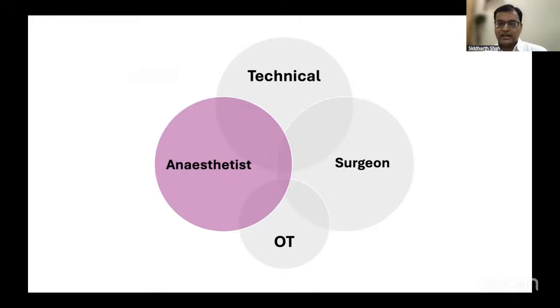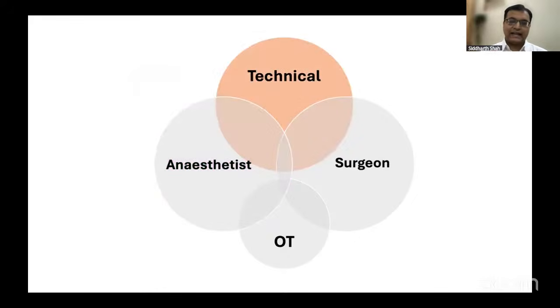So the first thing is, have the anesthetist do a check of all the parameters that the patient is going through, and feed them back to you and the technical team at the back. Both of us should be happy that everything is fine at the anesthetic end: the MAP is optimized, the temperature is good, the patient has a normal hematocrit, and all other anesthetic aspects are fine. Then we move on to the next aspect, which is the technical aspect.